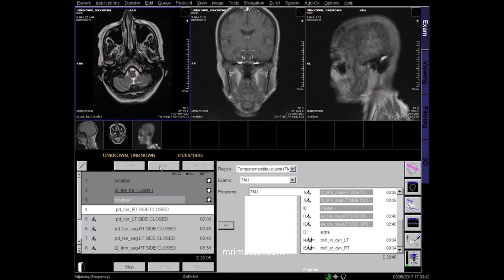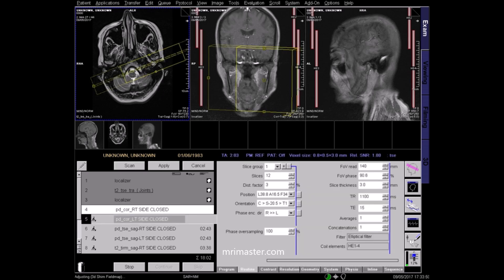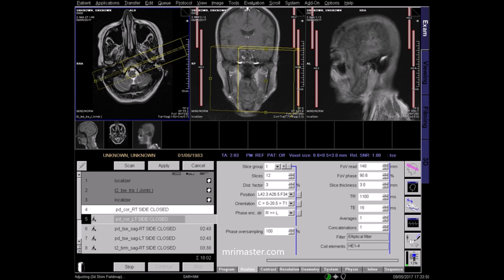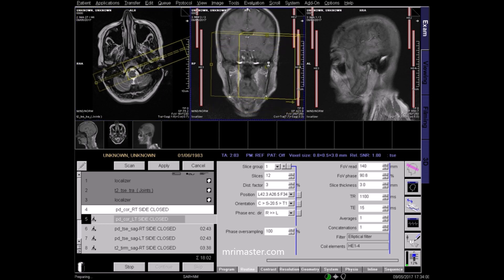Now follow the same method of planning for the left TMJ. Angle along the long axis of the mandibular condyle. Centre in the coronal plane, and angle along the ramus of the left mandible.